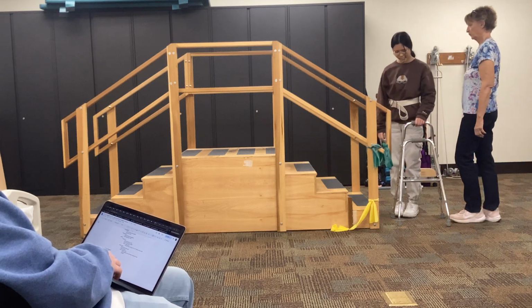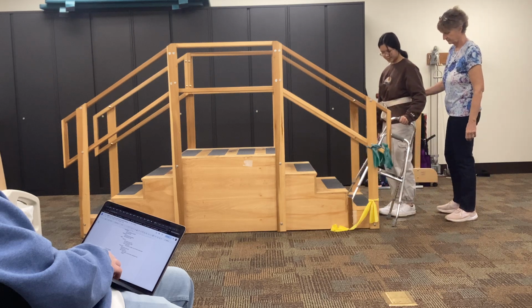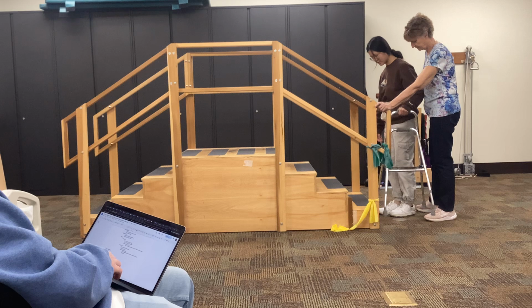Now what you gonna do? Same like using a walker. Or just using my legs. Okay, give it a shot. I would do good leg first. Okay.